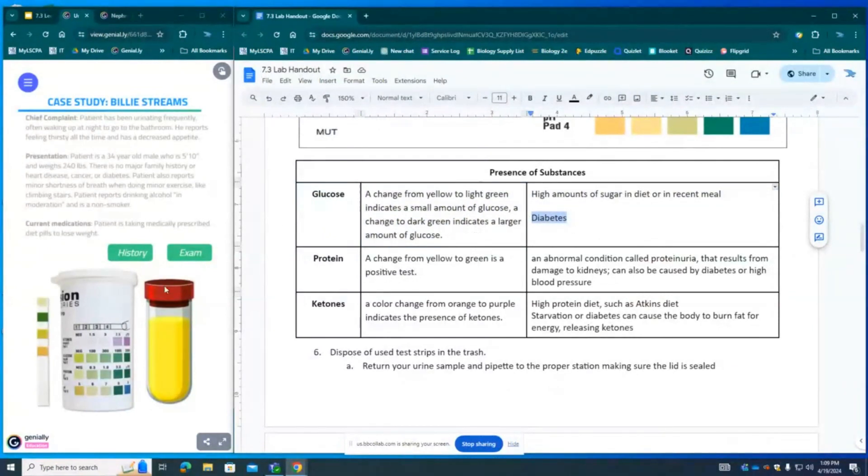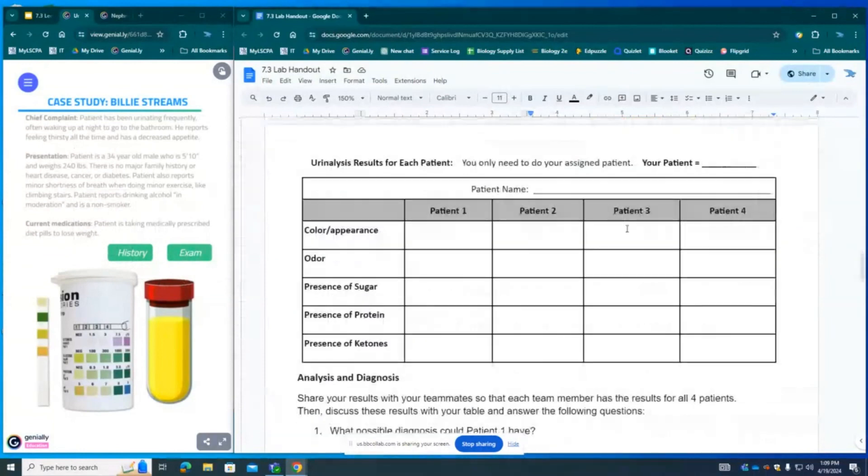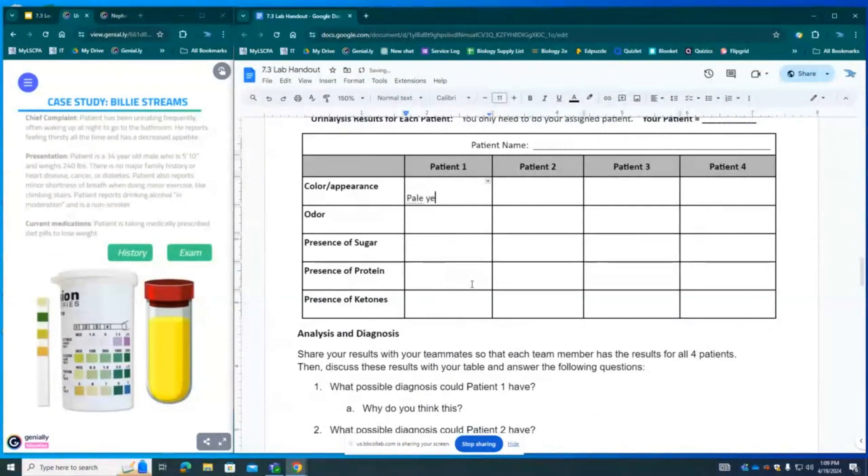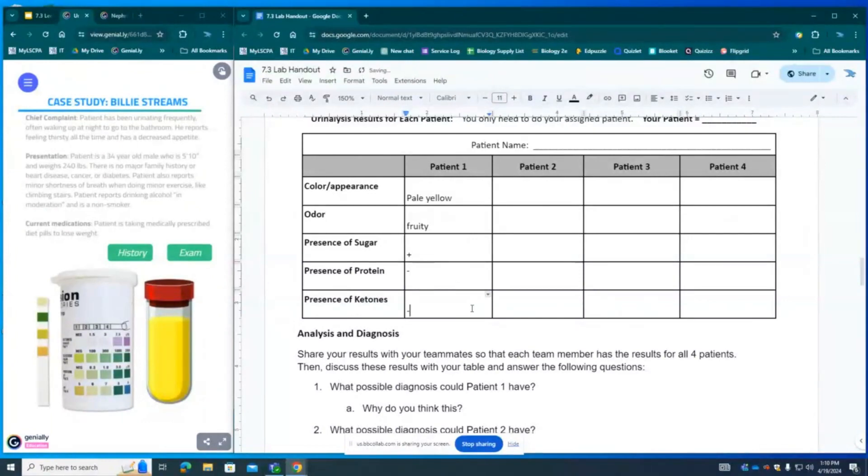So this is our interpretation for this patient. We're going to record our results for our patient. The color was pale yellow. The odor was fruity and they tested positive for the presence of sugars but negative for proteins and negative for ketones.